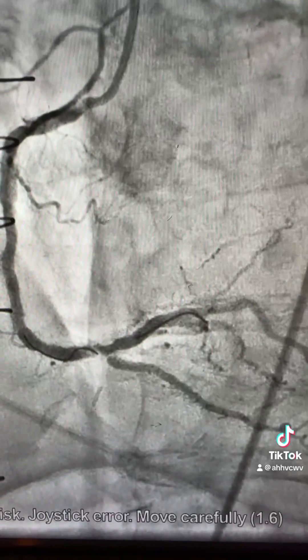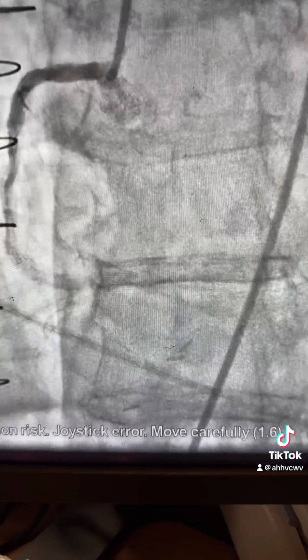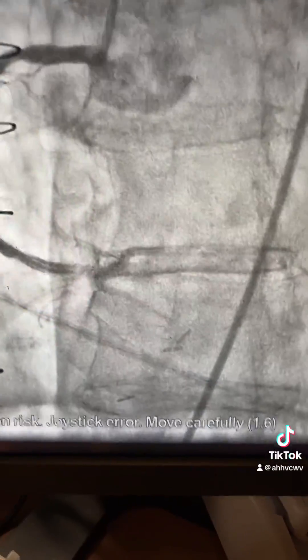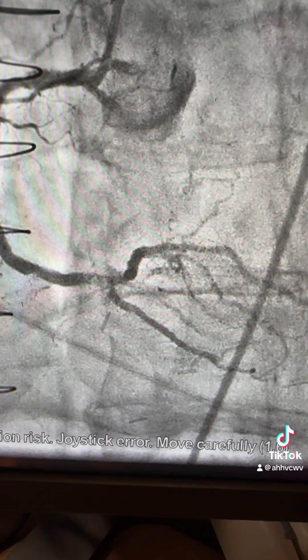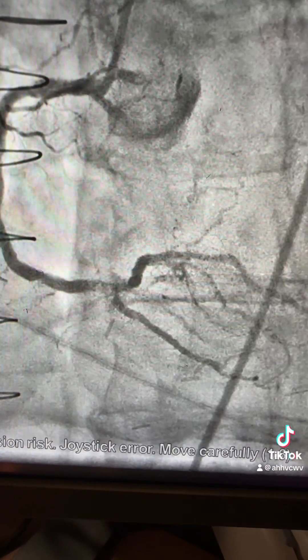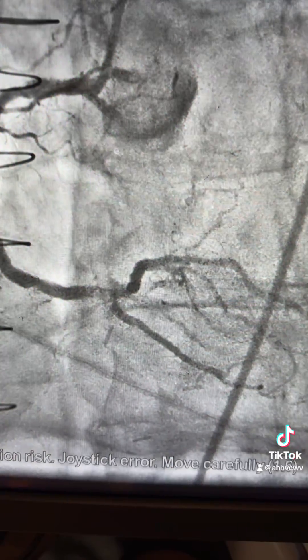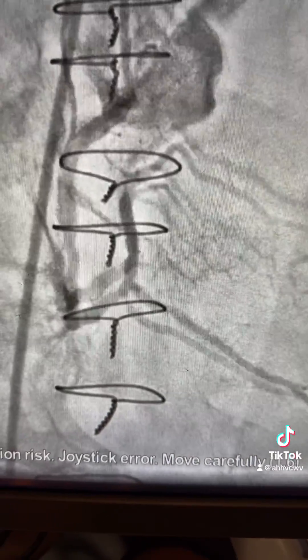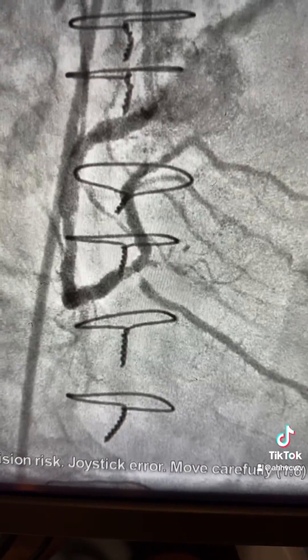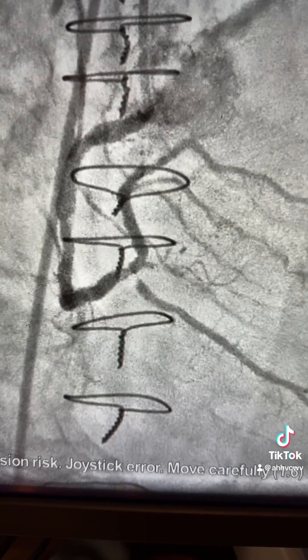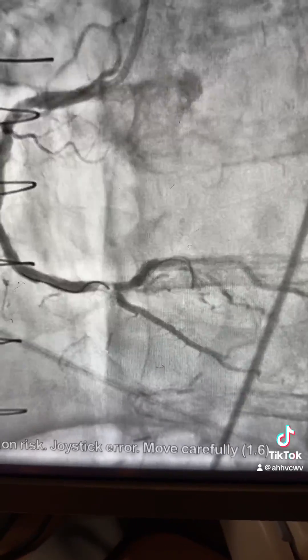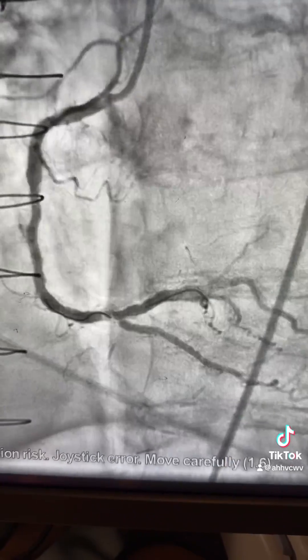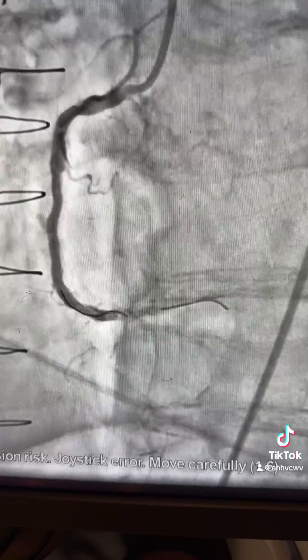This is the vessel before starting the intervention. As you can see here, the ostium of the PDA and PL — it's like a 99% calcified lesion. Going back with two wires: the first wire went smoothly toward the PL.